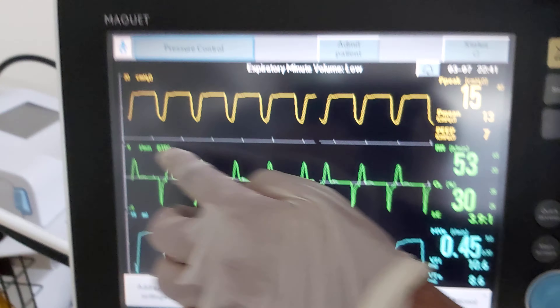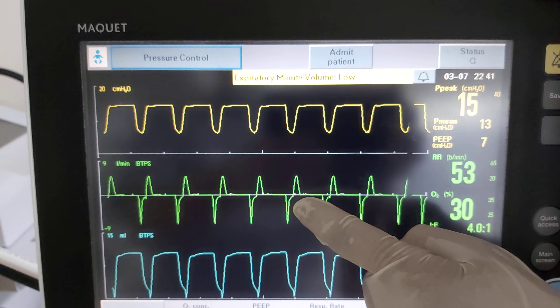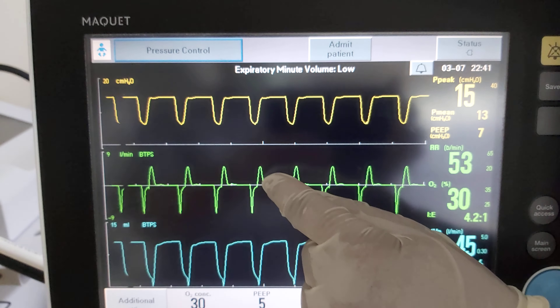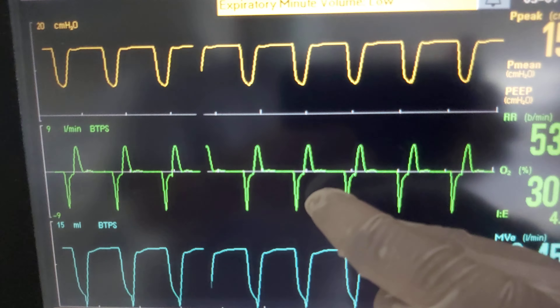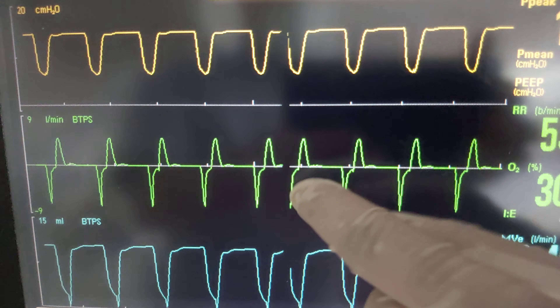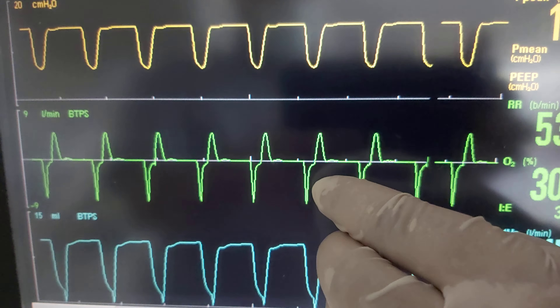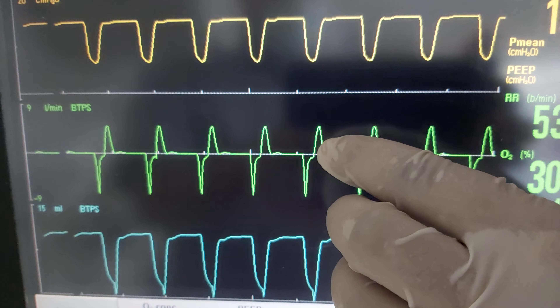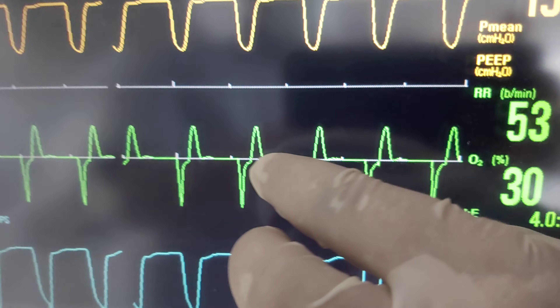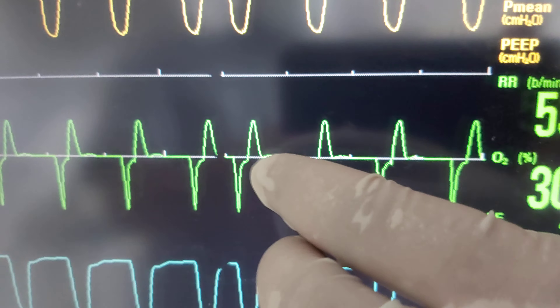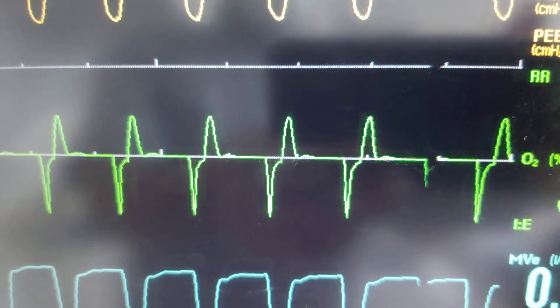Thank you, Dr. Taj. Here we have this scalar — it's called the flow-time scalar, the green one. This is inspiration and this is expiration. Here in the expiration, if the expiration is not returning to the baseline — not returning to the white line — it means that the expiratory flow is insufficient.